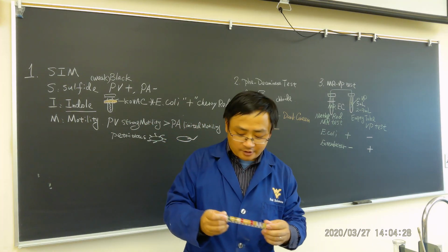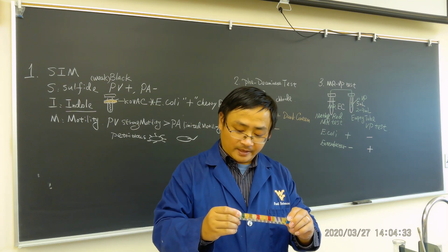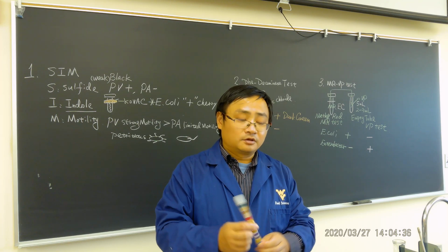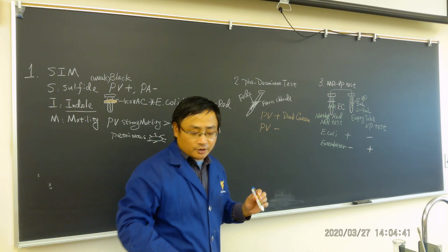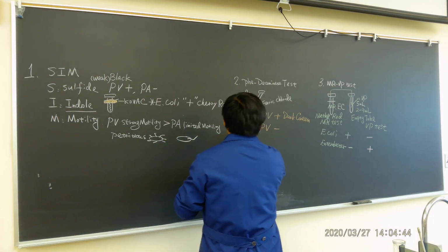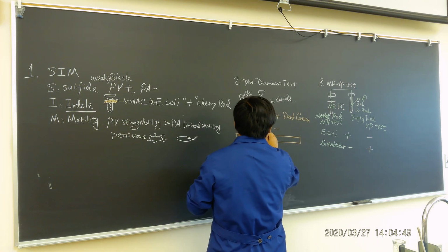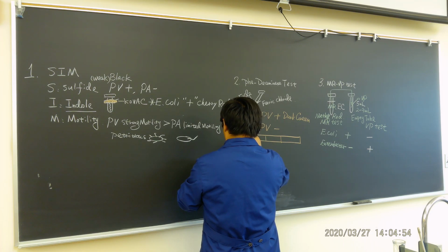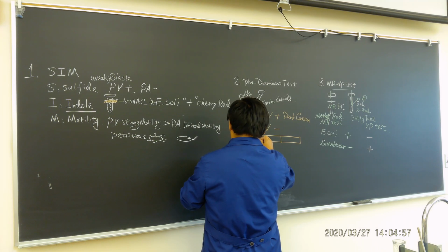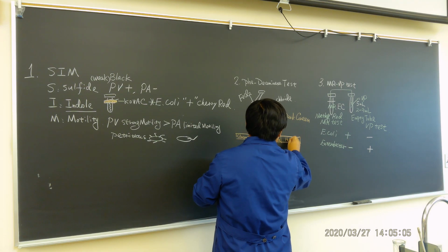The second thing, I'm going to be a little bit easy, not going to be too complicated. What we have to do is that each of them, originally, you see so many wells, is that right? Okay, I'll just give you 3 examples. For example, let's say we have a glucose. We have a lysine, for example. Then we have an ornithine. Okay, then we have a sulfide and indole.